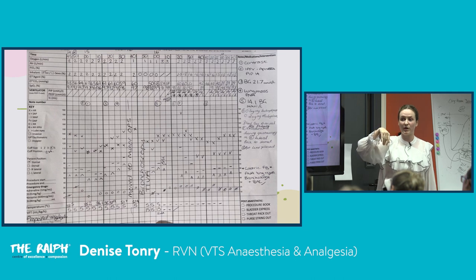I was outside in a minor ops room, and we have a portable ventilator, and we didn't have spirometry on this patient. So I was watching her lung movements, and I would say they weren't very big for the level of pressures that we were trying to provide.